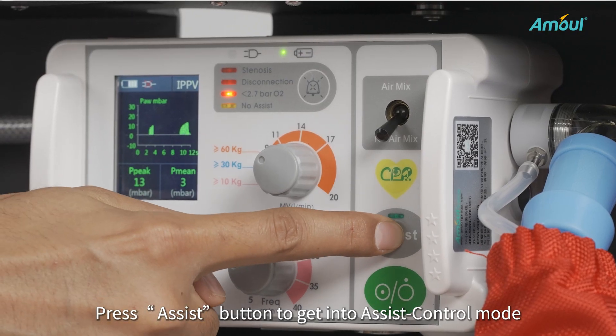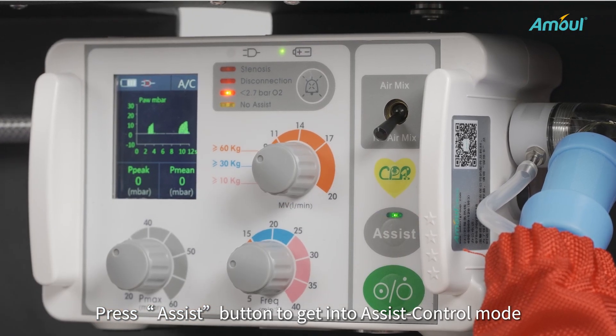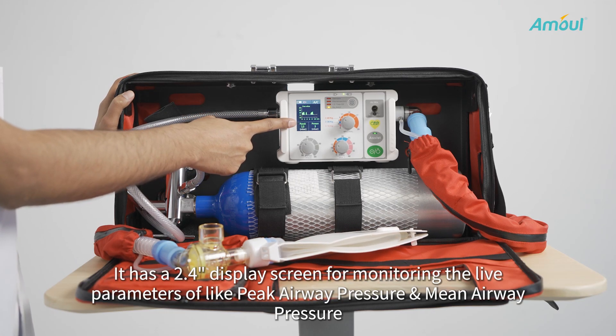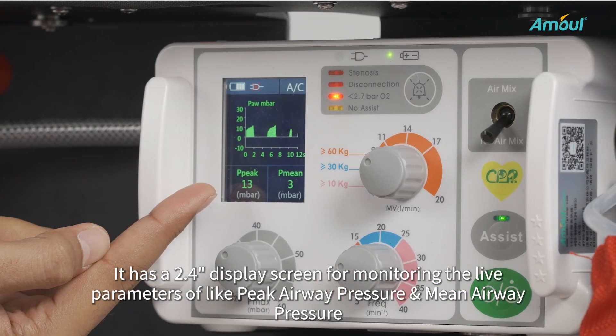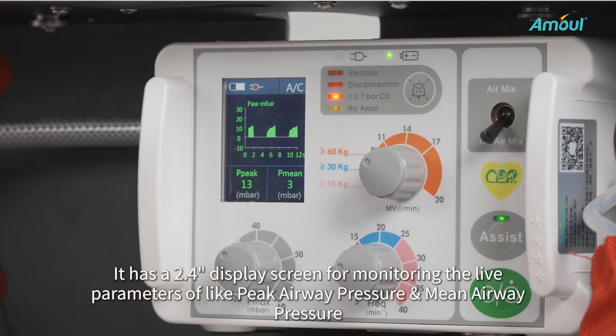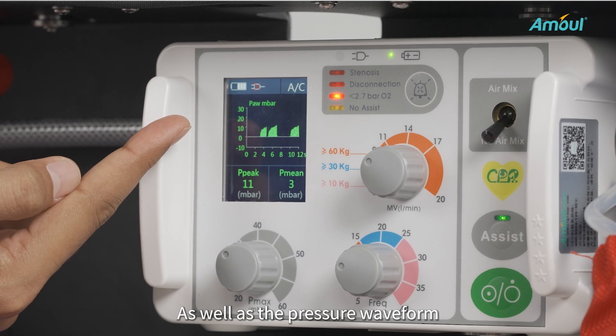Press the ASSIST button to get into ASSIST control mode. It has a 2.4-inch display screen for monitoring live parameters like peak airway pressure and mean airway pressure, as well as the pressure waveform.